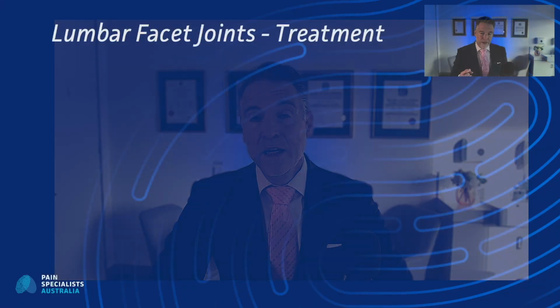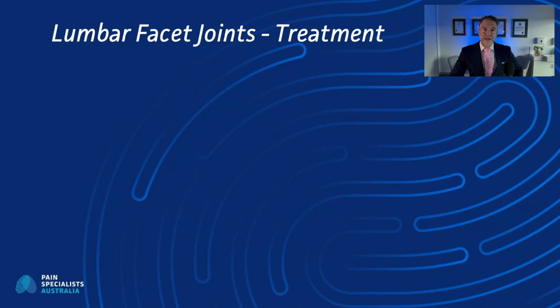Radiofrequency ablation for chronic joint pain is a fairly common treatment that is used to desensitize painful joints and alleviate some forms of chronic pain. One of the commonest joints that is treated is the facet joint. Facet joint pain syndrome, facet joint pain treatment is what we're going to be talking about today. How do you treat lumbar facet pain or facet joint pain?